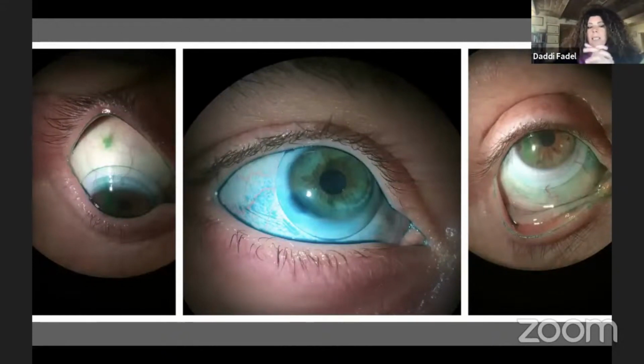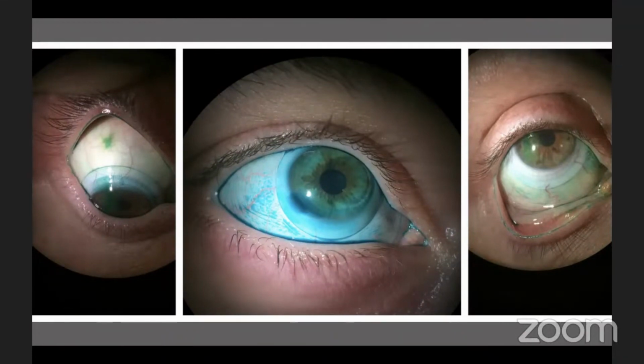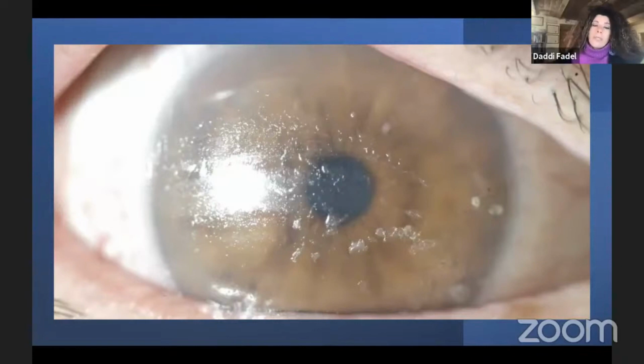When fitting scleral lenses, it's very important to check the presence of lid wiper epitheliopathy, since this condition is considered an early sign of dry eye, which can compromise the result of lens fitting. In these cases, the lens should be fitted as large as possible to protect as much as possible the exposed ocular surface areas. Wettability is an important issue when fitting scleral lenses in patients having ocular surface diseases.